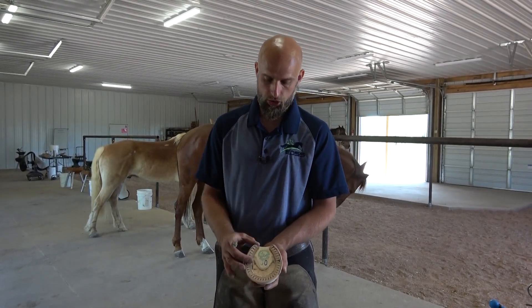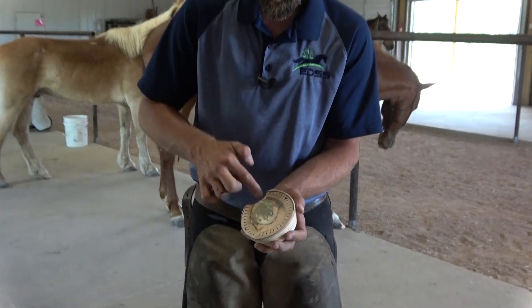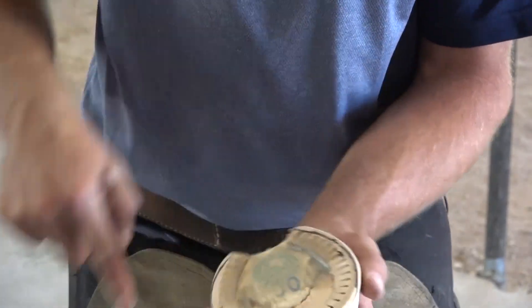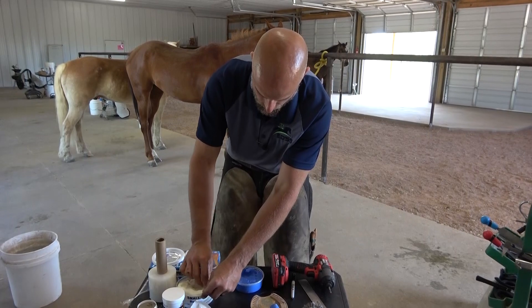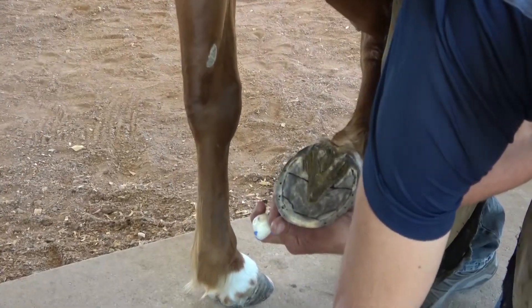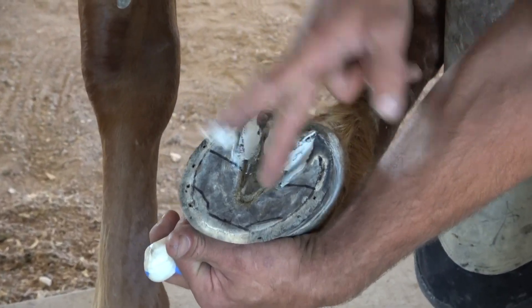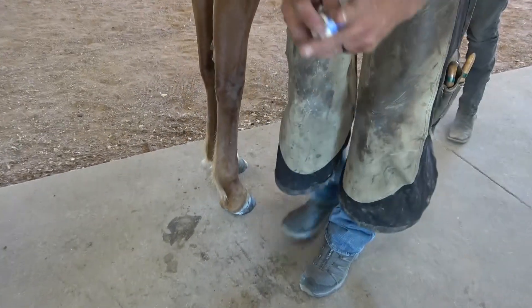We're going to fill the back of the shoe with dental impression material and use this as the impression plate all in one step. I'm going to use just a little feel paste — you can use anything that glue isn't going to stick to: Vaseline, a little moisture, whatever you have handy. We're going to use dental impression in the back of the foot and magic cushion in the front half. With dental impression it's a 50-50 two-part mix, so equal portions. We're going to put a little bit of Arty Mud in the commissures and central sulcus just to help combat bacteria through this process while the shoe's on the horse.